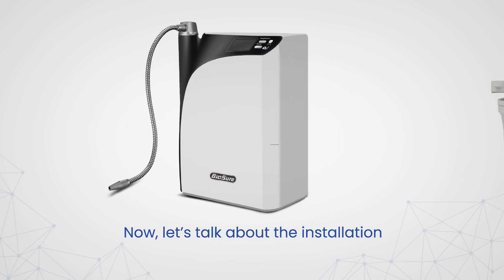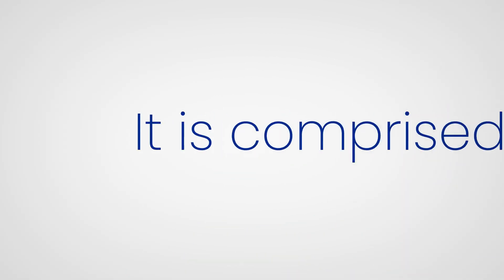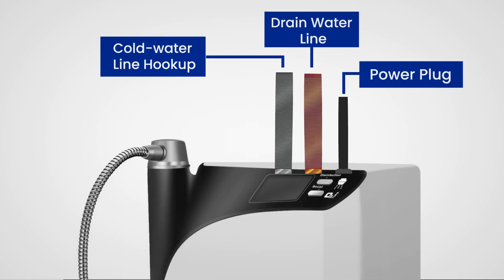Now, let's talk about the installation. Installing the BioSureCDU is as easy as installing a standard water filter. It is comprised of three components: a cold water line hookup, drain water line, and power plug.